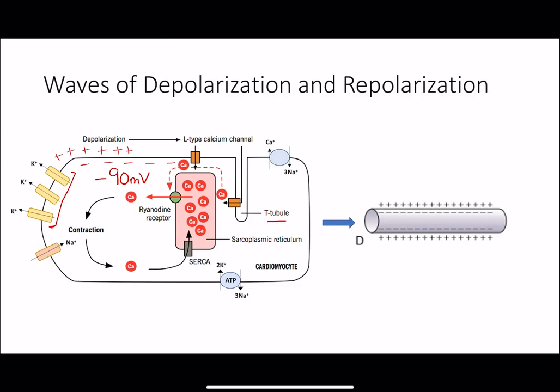So we can actually record the electrical activity in the heart by measuring when these charges change. We can put little sticky pads on our skin, and what we actually attach to our skin is called an EKG electrode, right? The conductive pad attached to your skin. And we can use those to record an EKG lead.